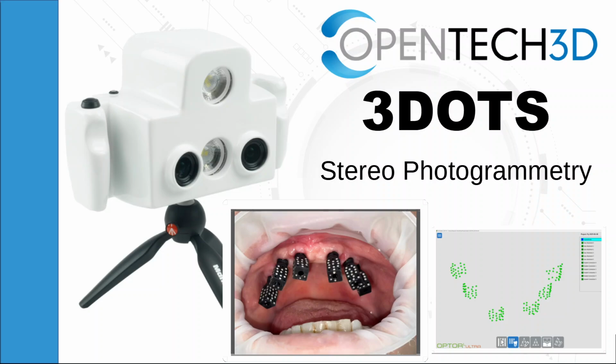The dental photogrammetry system today consists of a package composed of a photogrammetric scanner, a sort of camera that you see in the slide on the left, special photogrammetric scan abutments that are scan abutments with photogrammetric targets on their surface, which are mounted directly in the oral cavity in correspondence with the implants. And then a software that manages the hardware in all scanning phases, that allows the data to be processed to locate with extreme accuracy the position of the photogrammetric targets, thus of the scan abutments, and consequently to obtain with extreme accuracy the positions of the implants on which the same photogrammetric scan abutments are mounted.